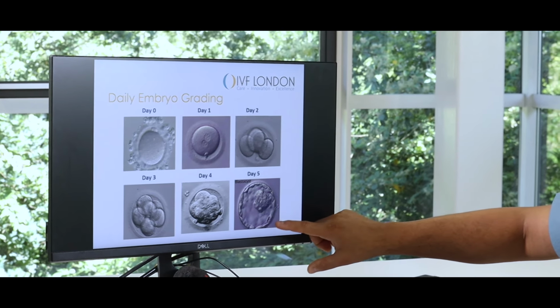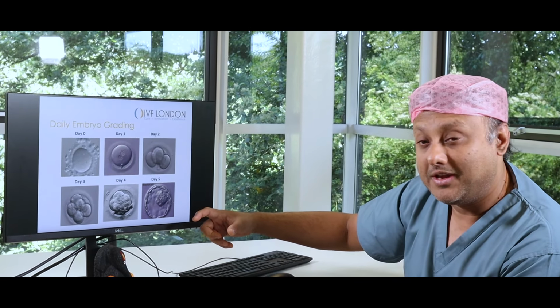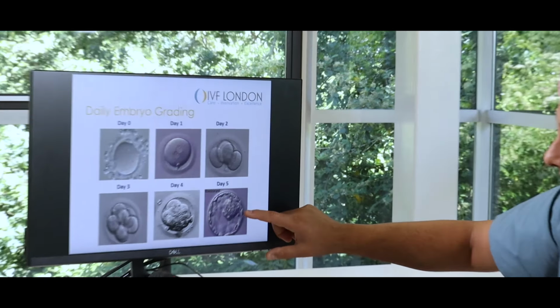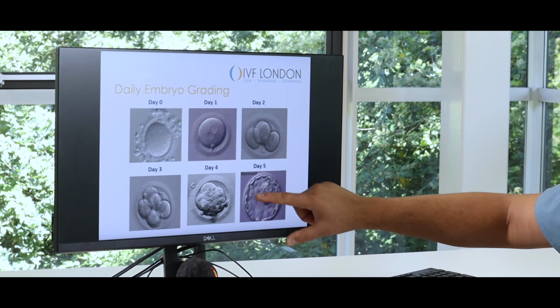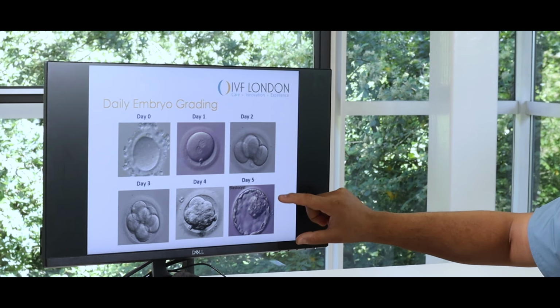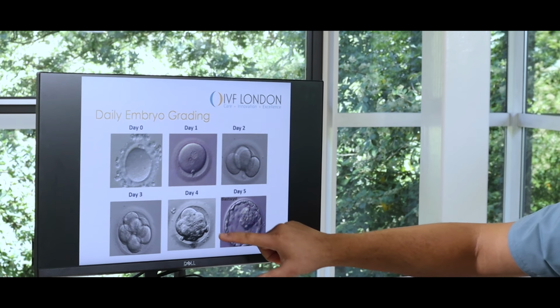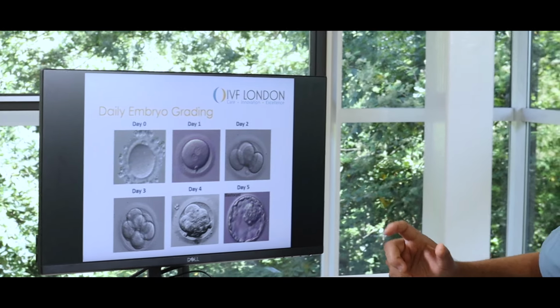So typically, what are we looking for as embryologists in the blastocyst that we are looking at under the microscope? We are looking at the health of cells of 2 different kinds. One is the inner cell mass, which is this big bulb of cells in the middle. Now you can see that that's a very nice rounded inner cell mass. That cohort of cells gives rise to the baby. All the cells around the embryo here, which are called the trophectoderm cells, give rise to the placenta.